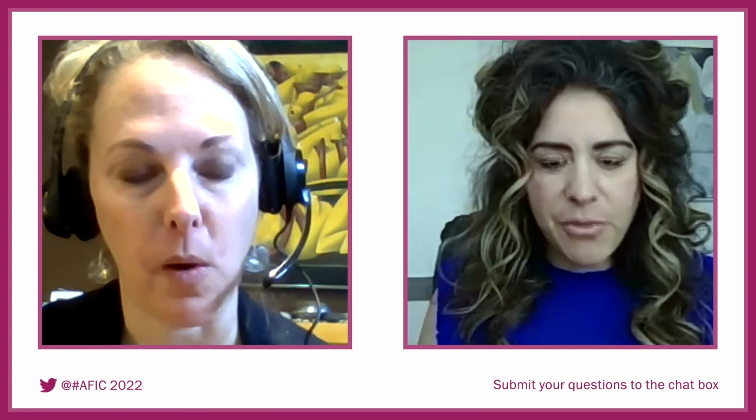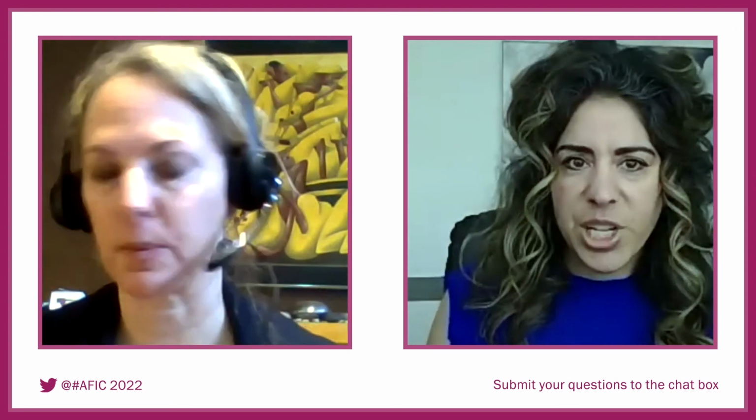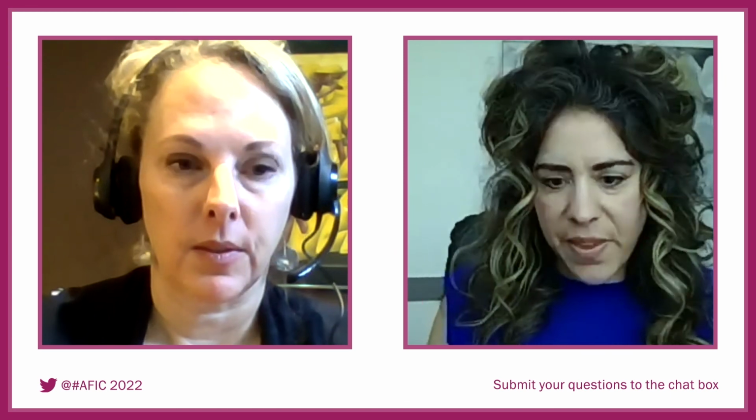So question, should we be training students using the Qscan or auto-optimize? Or should students be trained to work their way through all the different features so they understand how different settings affect the image? Myself coming from an old school scanning point of view, we were told that was the no button. We were not allowed to use Qscan. And I do appreciate the fact that I know how my machine works and what buttons do what things.